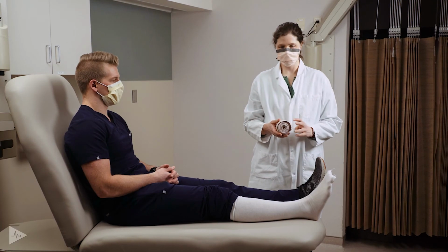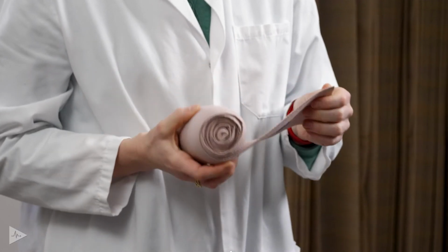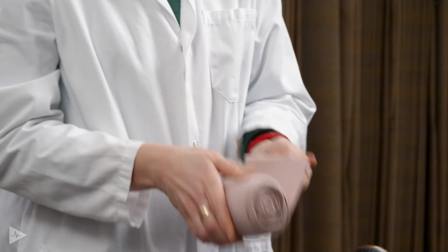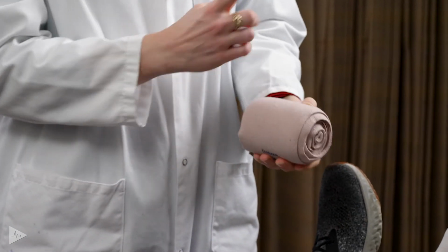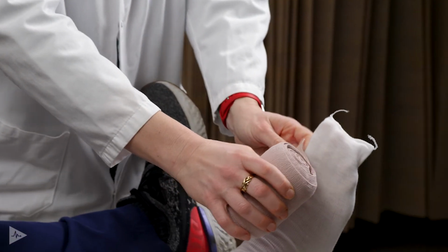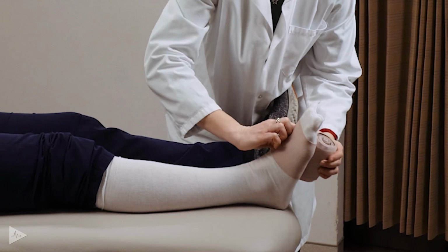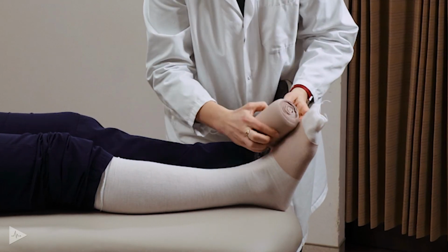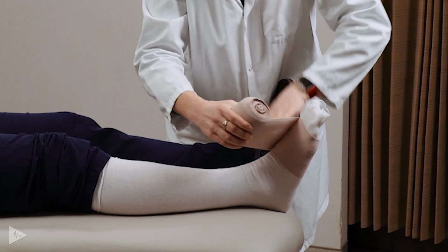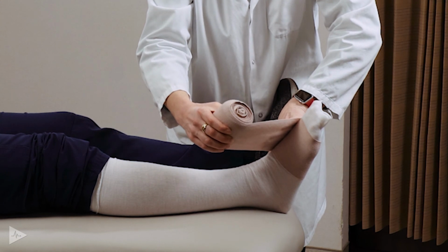So the next demonstration then will be the high stretch or ACE wraps. And these again are used on inactive patients. So very similar wrap to the low stretch. Generally the rolls are large enough that you only need 1 wrap for the entire leg. So again, you'll want to start at the base of the toes, bring that leading edge across the top of the foot, and this is where stretch is important to monitor. So we want to try to get a fairly high stretch, but not a complete stretch in the foot. We're going to aim for about 60%.